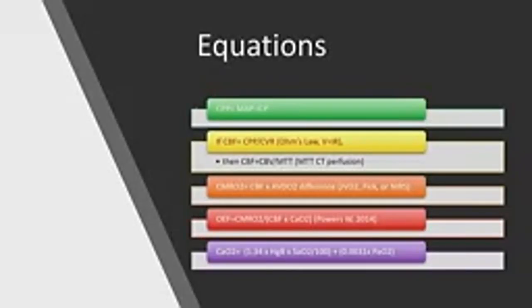Back when Ricardo and I started measuring this in stroke patients, the hypothesis was, could we use non-invasive NIRS as a surrogate for cerebral blood flow? So they're different units. That's important to remember. They're fundamentally different things to measure, but one could be a surrogate of the next.